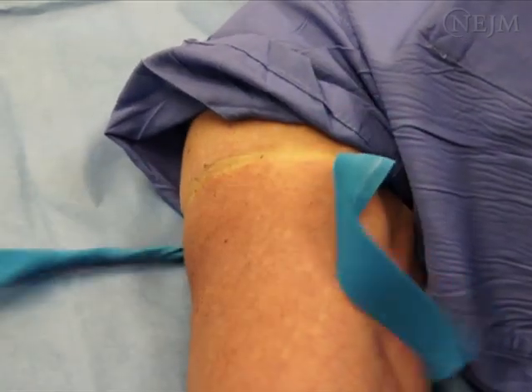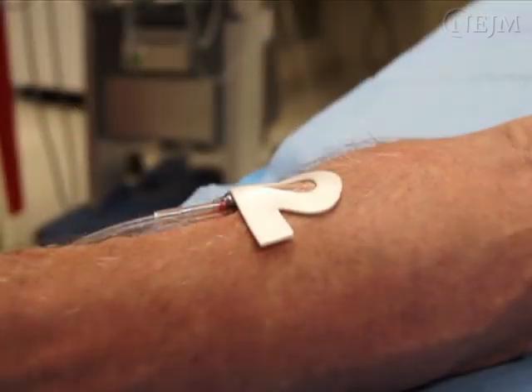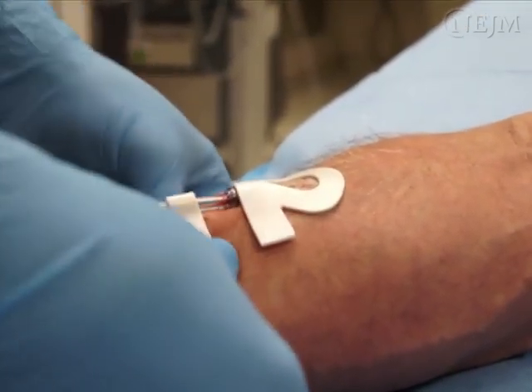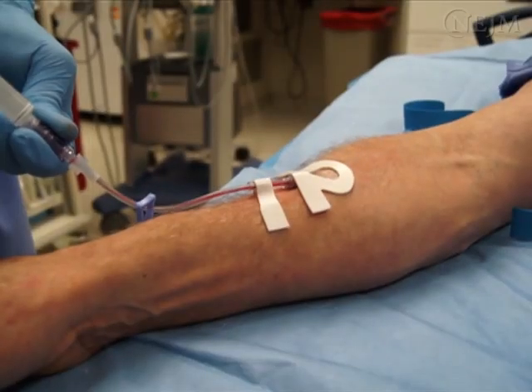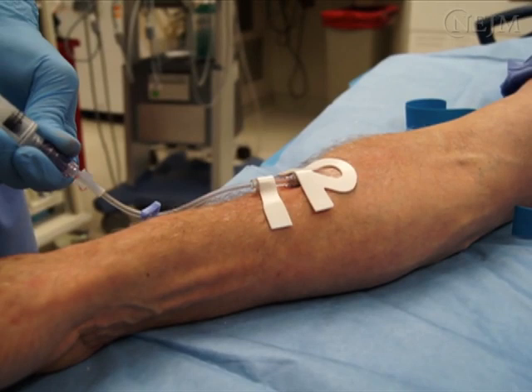Remove the tourniquet. Place the luer lock adapter on the end of the catheter. Anchor the catheter, adapter, and connection tubing to the skin using adhesive dressing. Flush the catheter with sterile saline. The flush should flow smoothly into the catheter. If there is resistance, the catheter may be kinked, occluded, or outside the vein. Look for signs of extravasation, such as pain, swelling, or blanching.